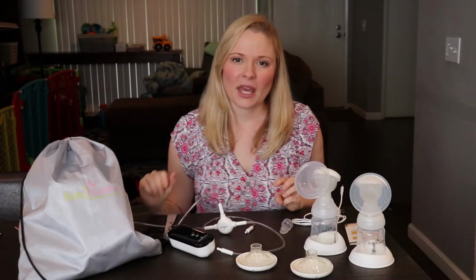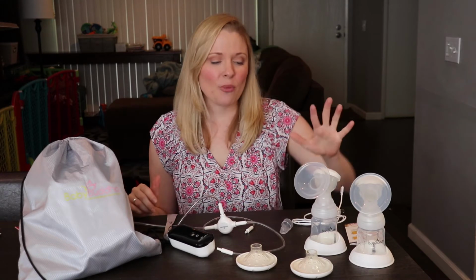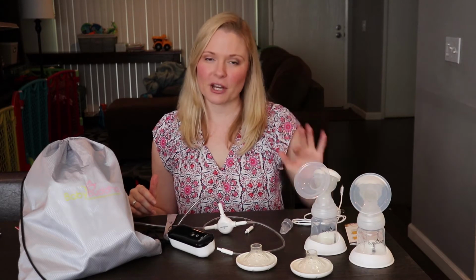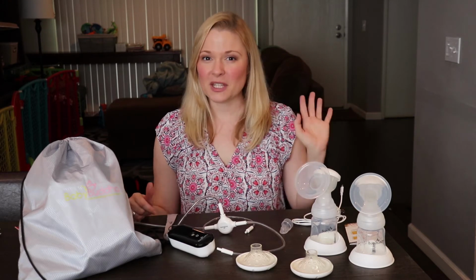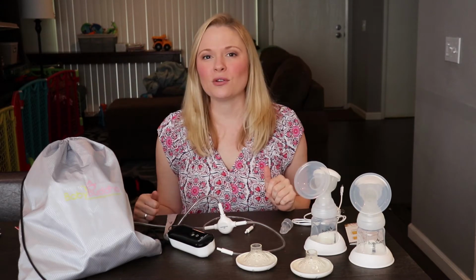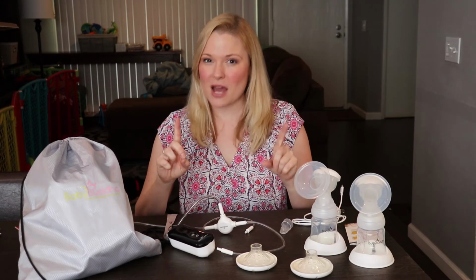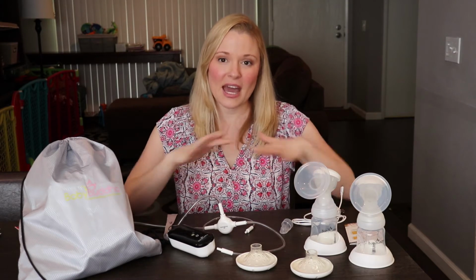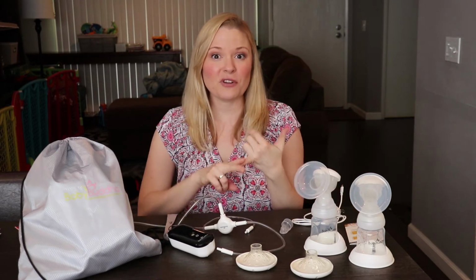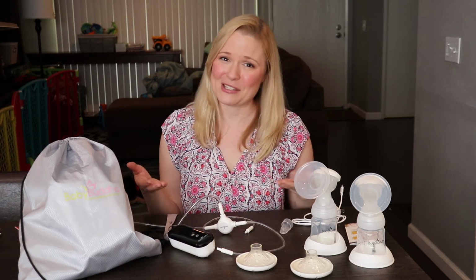Con number 3, and Baby Buddha has made some significant strides in trying to remedy this, but your flange sizes are very, very limited. So if you feel like you're between 2 sizes, like maybe you're not a 24, you're, I don't know, a 26, and you're not a 28, you might not be able to find the correct flange size for you. Now, there are workarounds, there are hacks, and I have hacked this Buddha to fit Freemie cups and a couple of other things, but I feel like at the $200 price point, you should be able to get something that fits you properly.